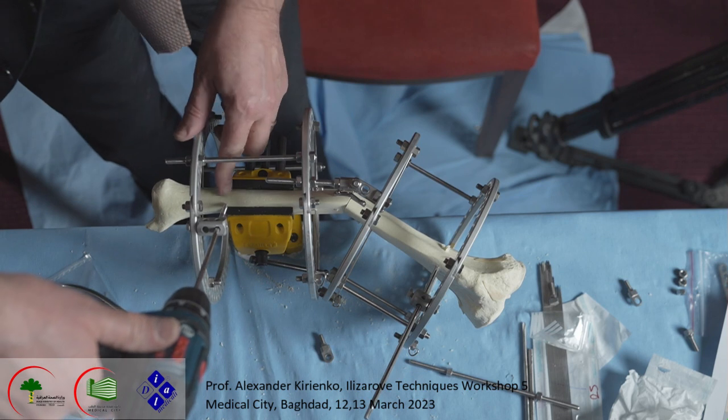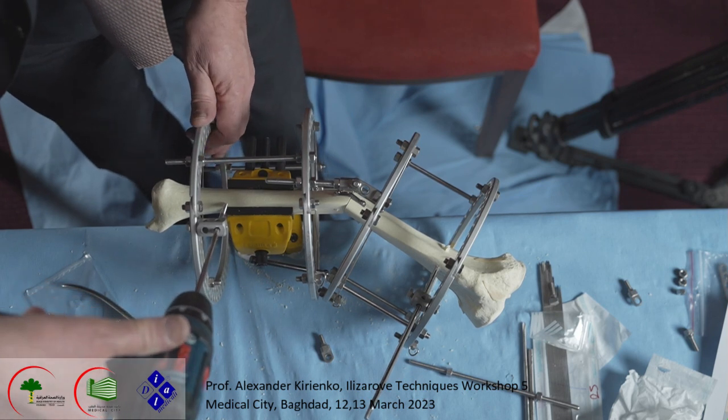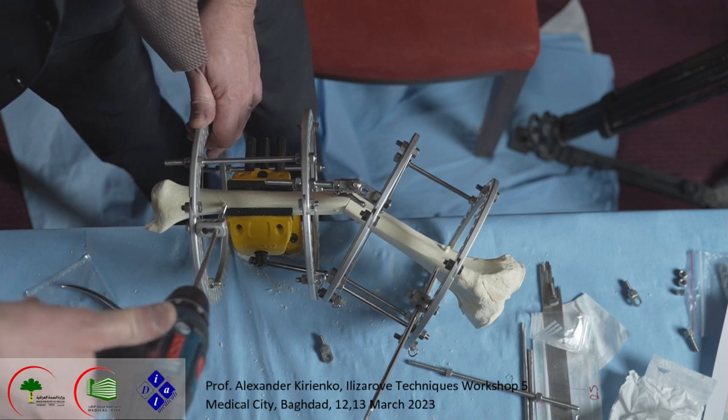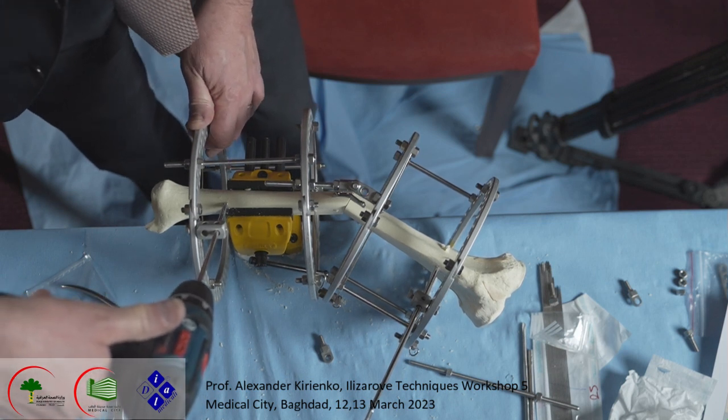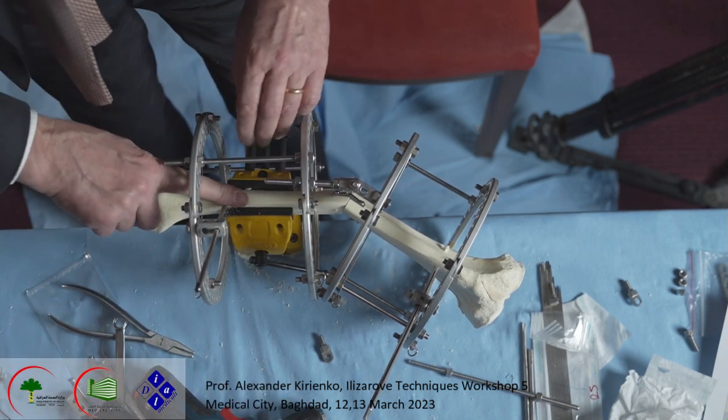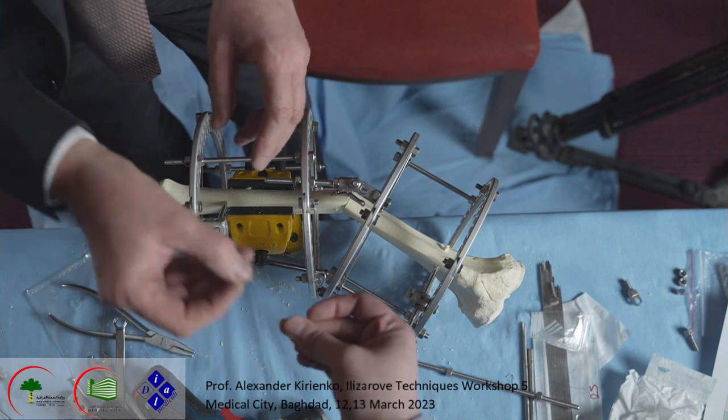Distal tibia. We don't have a fibula here, but you need to fix the fibula, obviously, with the wires like I explained before.